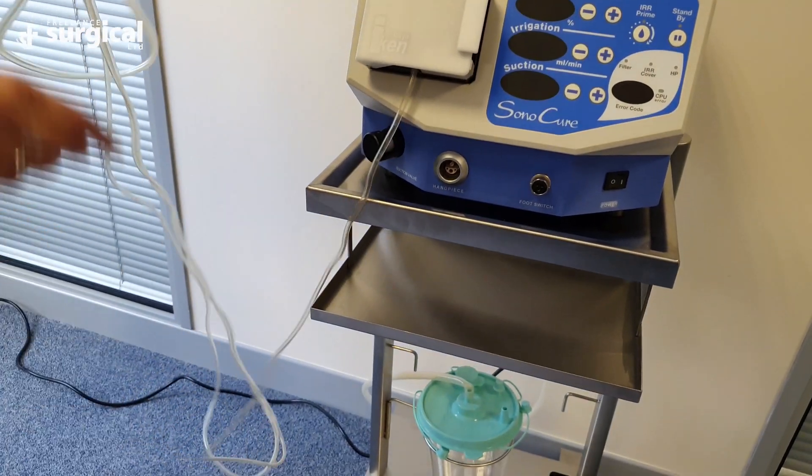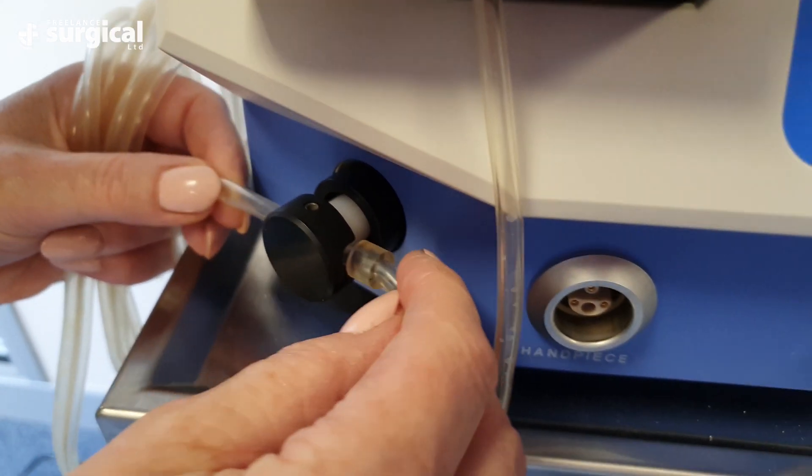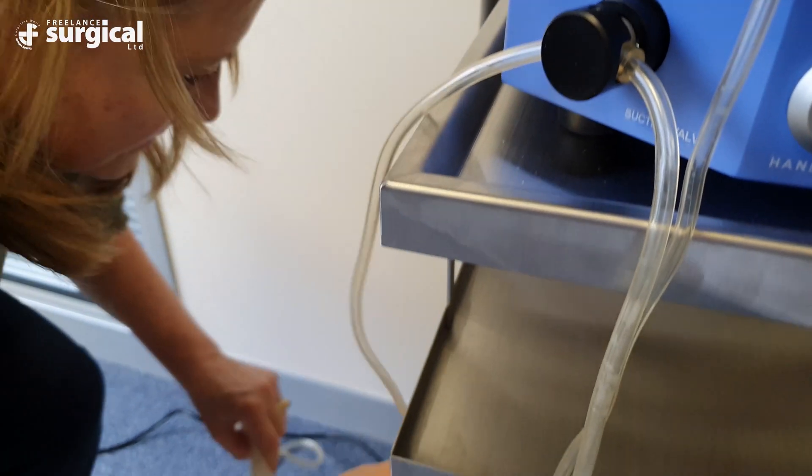Attach the second line to the patient connector and ensure that the rubber stopper on this line is positioned with the stopper on the right hand side of the suction valve, with the tubing positioned between the black valve and the white stopper. The positioning of the tubing in the suction valve is an important feature as it enables the tubing to be crimped when the generator is placed into the standby mode.